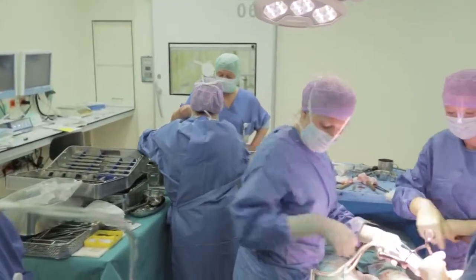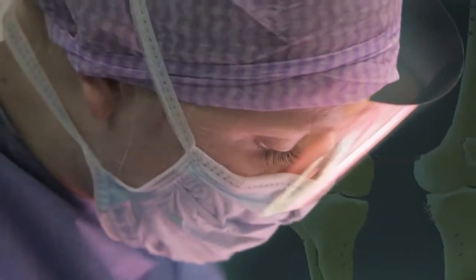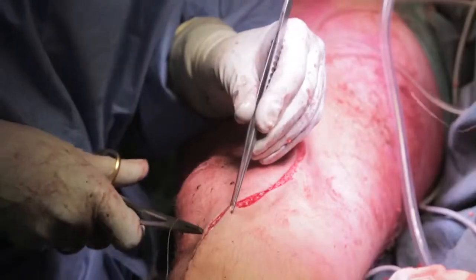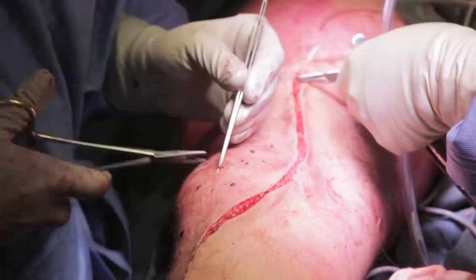The surgery is performed as was previously planned in the computer model. The tumour is removed, the prosthesis is placed, and the muscle transfer is carried out. Concluding the successful surgery, the wound is closed.